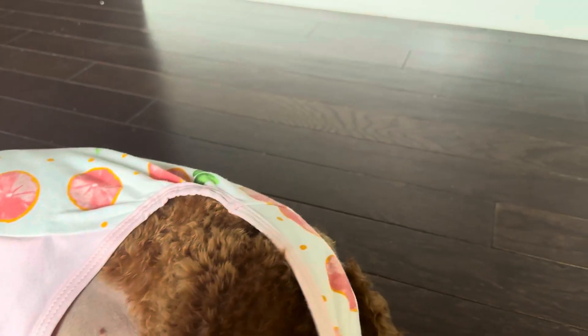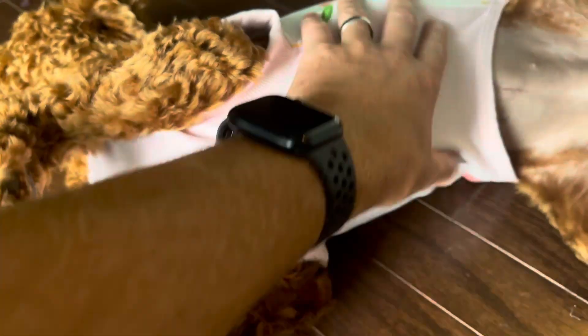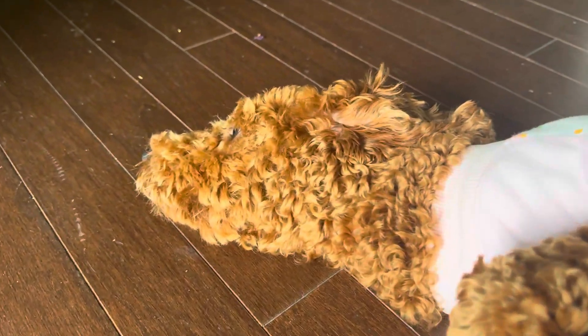And then you put it back on with ease. But overall, this is a great product. She loves it. She thinks she's cool because she's got a nice outfit on and she doesn't have to wear a cone. So go get you one of these bad boys and take care of your dog during their recovery, and they'll be happy for it. That's the review.